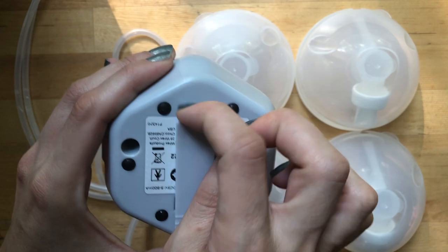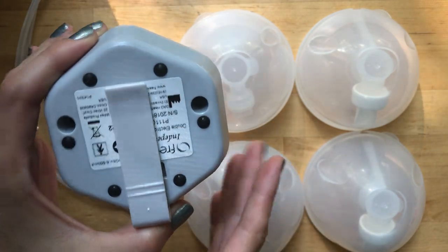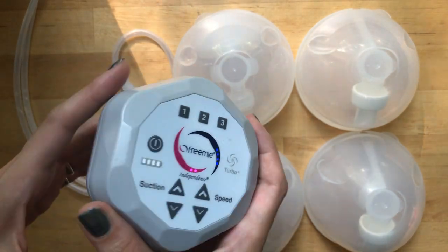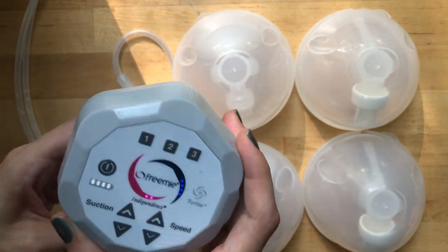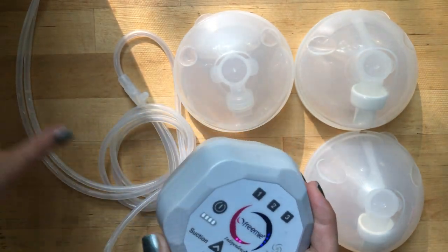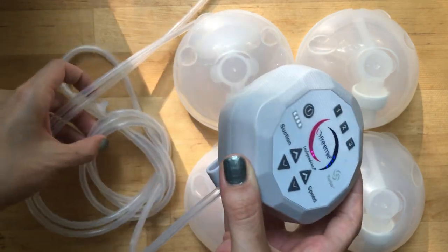If you flip it over, there's a little clip that allows you to clip it onto your waistband or jeans to easily carry it around. The whole thing isn't terribly heavy. If you're wearing sweatpants or leggings it'll pull a little bit, but I haven't had any problems with it pulling too much.